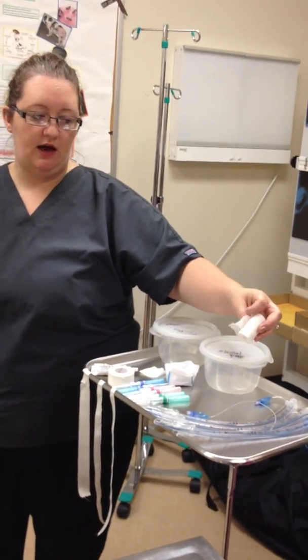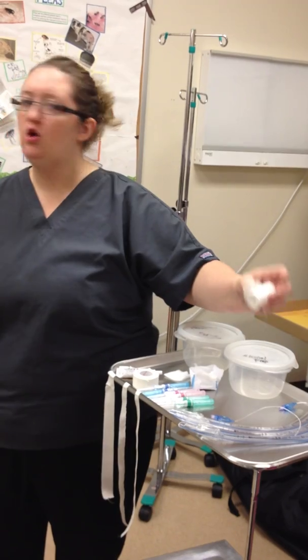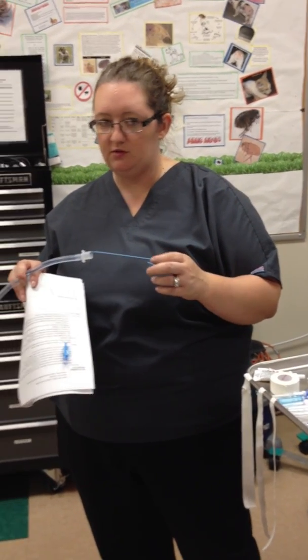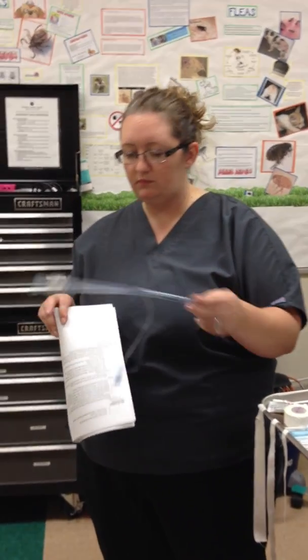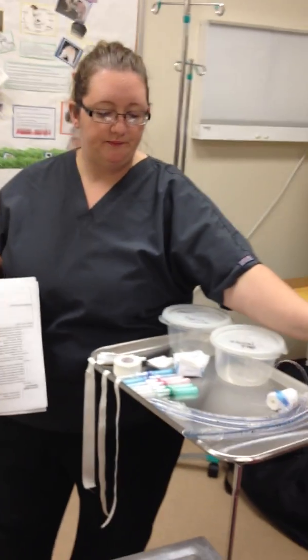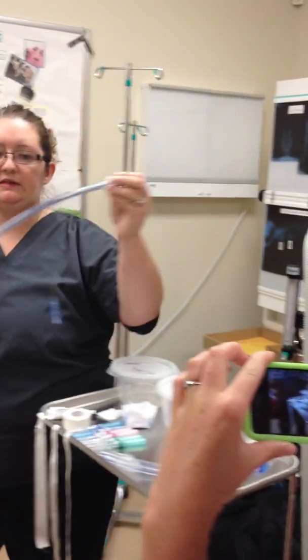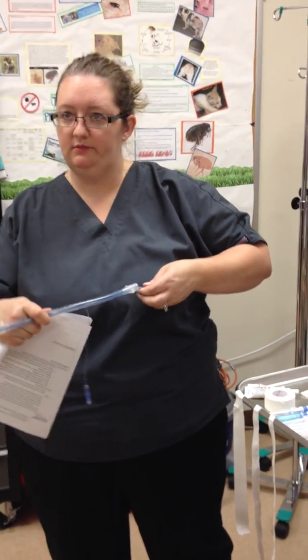You're going to have the roll gauze to secure it in place. You can use a stylet — usually we use stylets for the smaller ET tube sizes, not necessarily for the big ones. The thing with this stylet though is if you push it all the way in and it goes past, you need to bend it. You can bend these — so that it doesn't go past the tip. It'll puncture right through the trachea if it goes past.